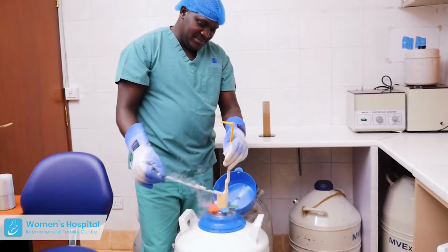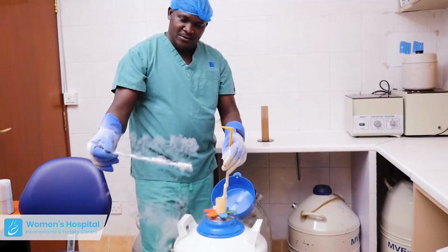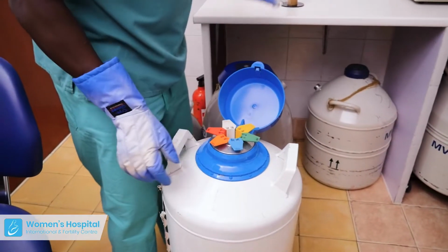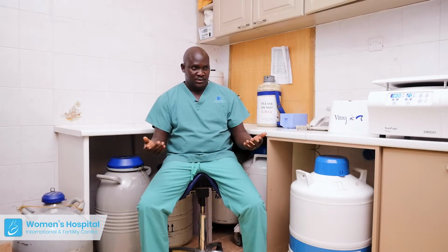Because we are talking gametes, in most cases, there's not much cutoff time in reference to how long a sperm or an egg can be kept. I know of a sperm sample that was frozen for over 25 years that was used to have a child. Of course, there are other issues that may arise with that, but it's just a seed, so we can keep them for a very, very long time, for as long as liquid nitrogen is there and there's somebody to replenish the tanks every now and then.